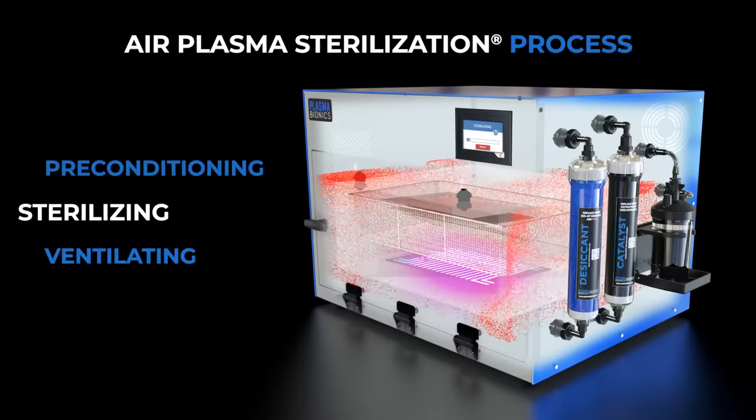During the sterilizing step, the preconditioned air is converted by plasma into sterilant gases that rapidly kill microorganisms on instrument surfaces.